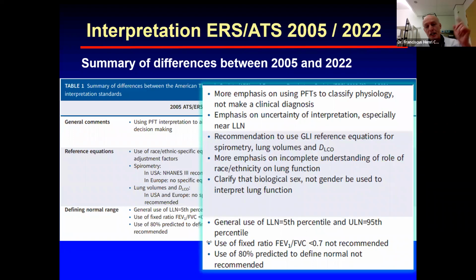So what I did then was go back to the internet, to PubMed, and find an article which has reference values for people in the big cities of Iran and Iraq. And then I found out that in this case, people had a vital capacity and a TLC which were almost 1 liter lower than the GLI mixed or other reference values. So we still have a way to go, because for certain ethnicities the GLI isn't perfect either. And it becomes more difficult if your father is from one side and your mother is from another side, what is the ethnicity? Even if you pick the mixed, you still can make a mistake.